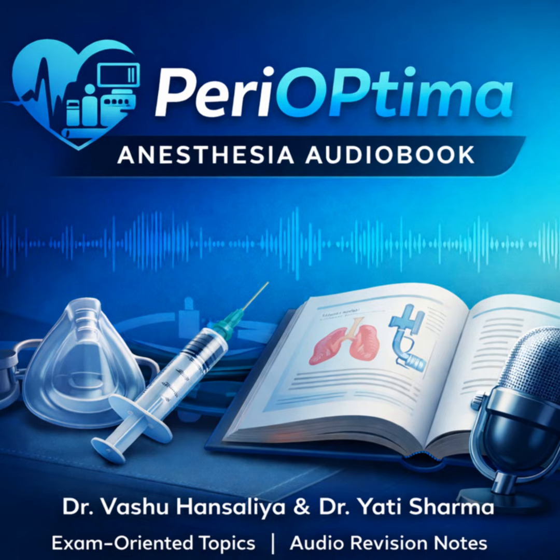And for the pipeline supply, the wall outlet. That is handled by the Diameter Index Safety System, or DISS. DISS. And DISS is mandatory for all the low-pressure connections, usually around 50 psi at the pipeline inlet. Where the hose from the wall plugs into the machine. Exactly. And DISS uses combinations of distinct, non-interchangeable threaded connections and nipple diameters. Its whole purpose is to prevent you from connecting the machine's oxygen hose to, say, the vacuum port or the nitrous oxide outlet on the wall.